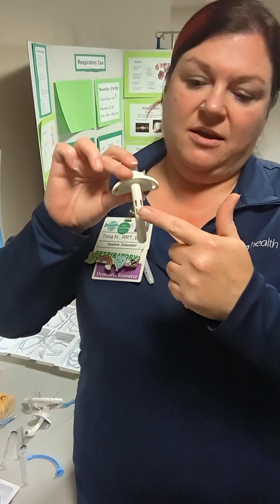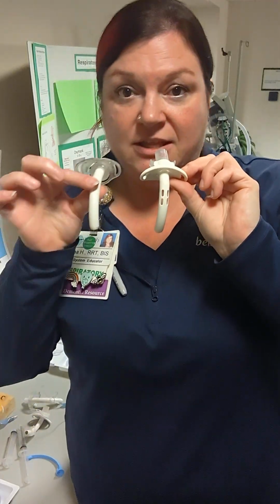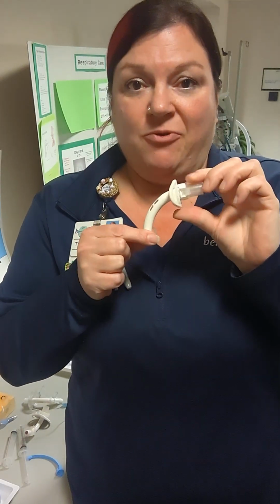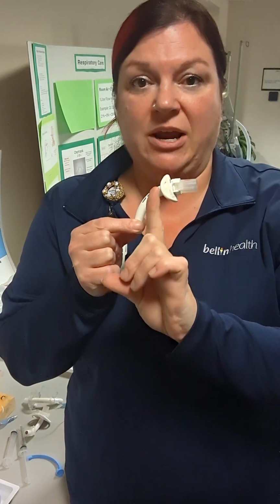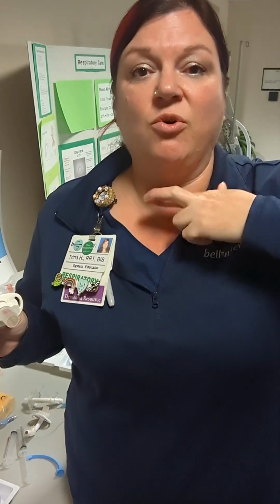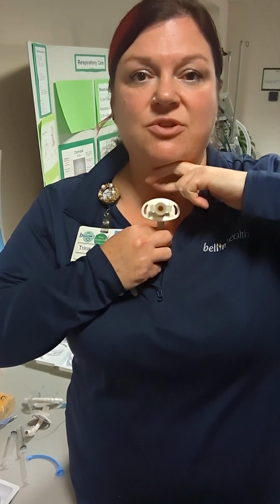This trach has fenestrations. Those holes that we see here, those are called fenestrations. This trach is non-fenestrated, meaning there's no holes. And these holes allow for air movement, not only the typical in and out of the trach, but also for air to pass up into the upper airway, which is where our vocal cords are. Our vocal cords are here, and the trachs are typically distal to the cords.